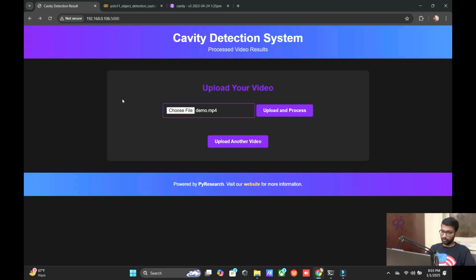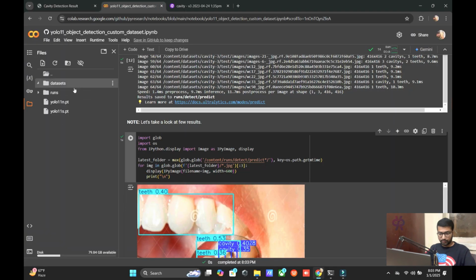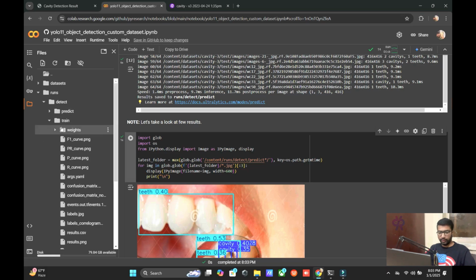So let's start from the code side. After that, you can see here run detection and here training. Okay, so wait, open the folder and download the last model. I have both models, but in front of you, you can see the process. Your last model is successfully downloaded.